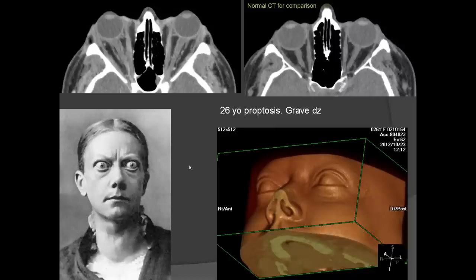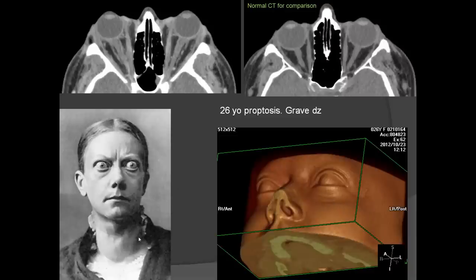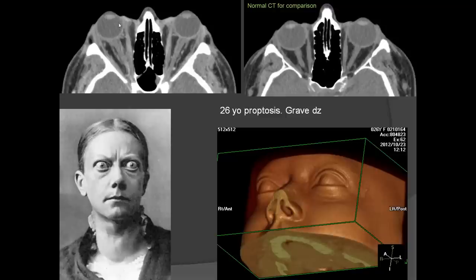Graves' disease is an autoimmune disease causing intraconal inflammation, including enlargement of the extraocular eye muscles and fat. This results in too much volume behind the eye, pushing the eyeball out — the patient may have trouble closing their eyelid. This is thyroid eye disease, typically affecting 20–30-year-old women. On imaging, the normal eye sits properly in the orbit; the abnormal eye protrudes significantly — this is called proptosis or exophthalmos.